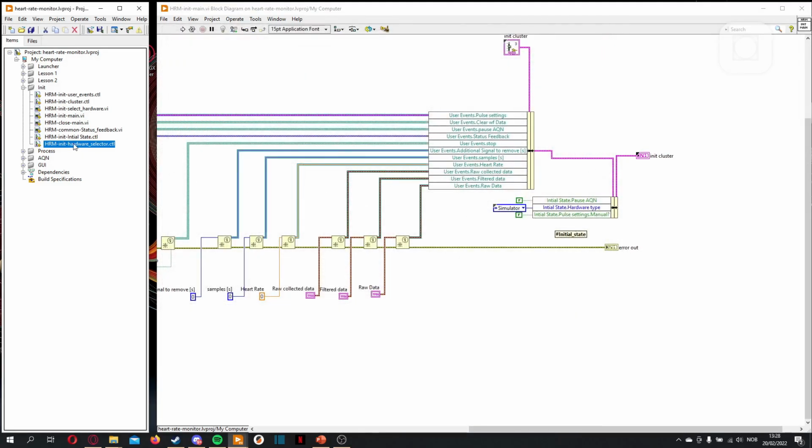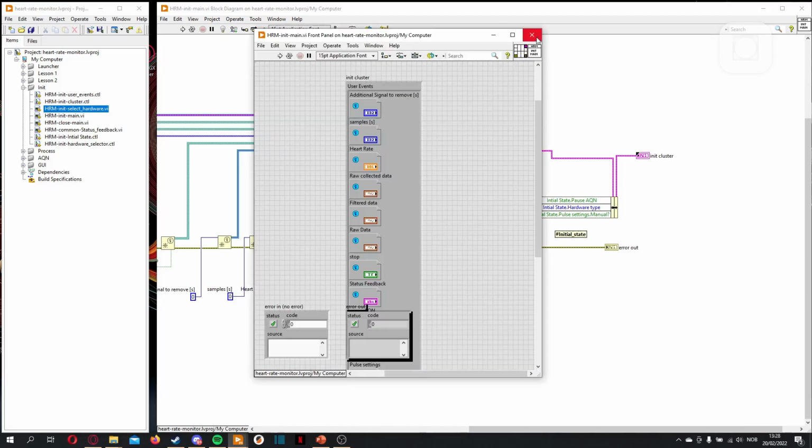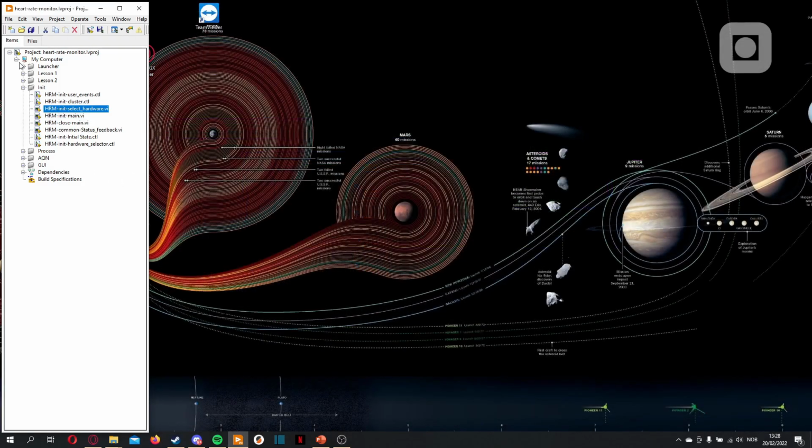Now you just put this here, and replace this with this one. Let's try to start this application now, into the launcher.